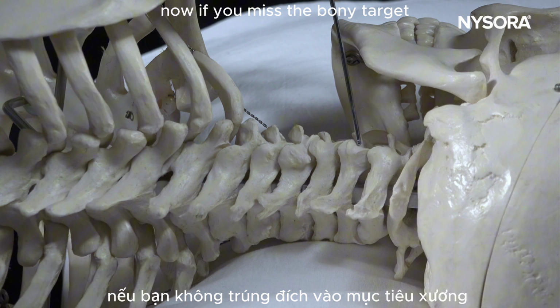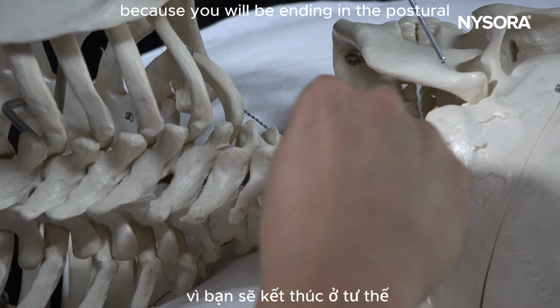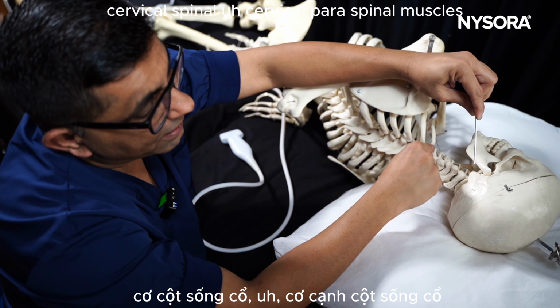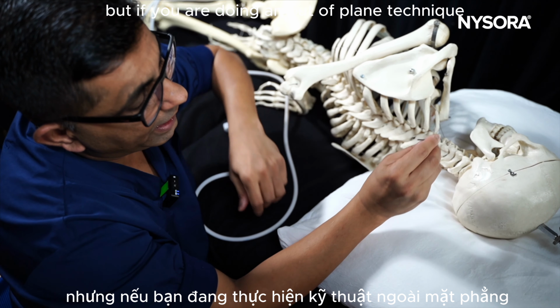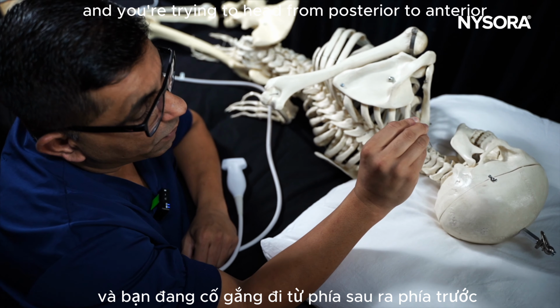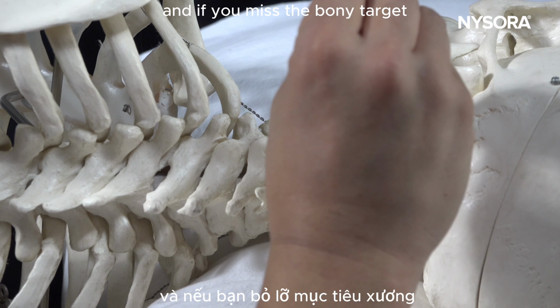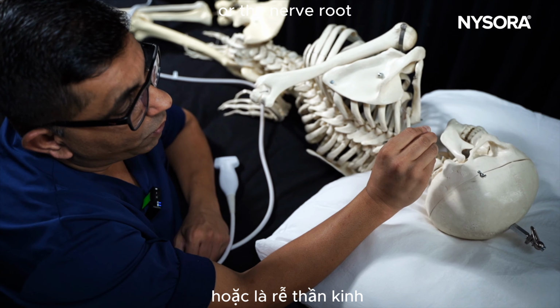Now, if you miss the bony target, you will still be safe because you will be ending in the posterior cervical paraspinal muscles. But if you are doing an out-of-plane technique and heading from posterior to anterior, and you miss the bony target, you will end up either in the vertebral artery or the nerve root.